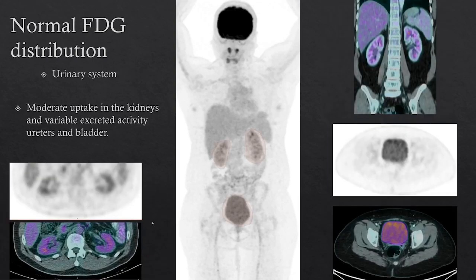In the urinary system, you'd see moderate activity in the kidneys. FDG is excreted through the kidneys, so you'd see variable activity in the ureters and the bladder. If the patient is well hydrated and voiding well, you won't really see any activity in the region of the ureters. But you can see quite prominent activity in the bladder and the ureters if there's a lot of retained tracer.